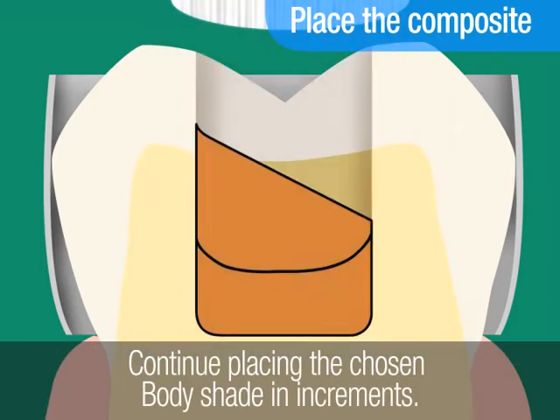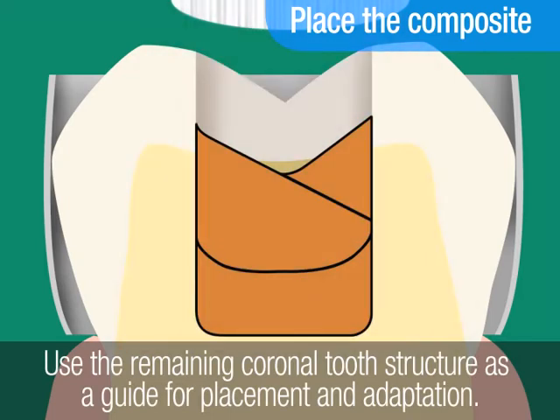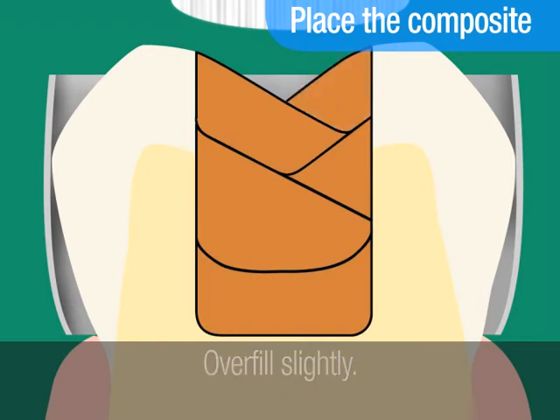Continue placing the chosen body shade in increments. Use the remaining coronal tooth structure as a guide for placement and adaptation. Overfill slightly. Light cure after each increment.